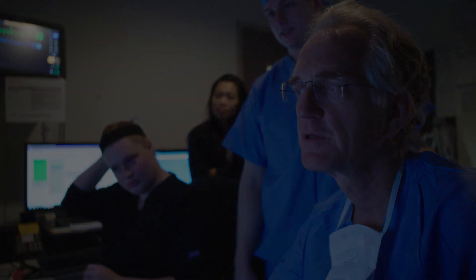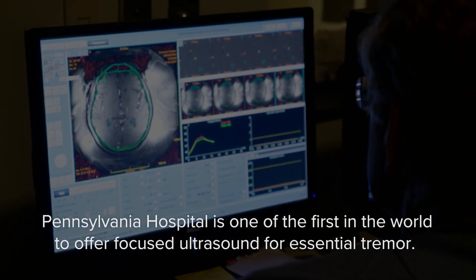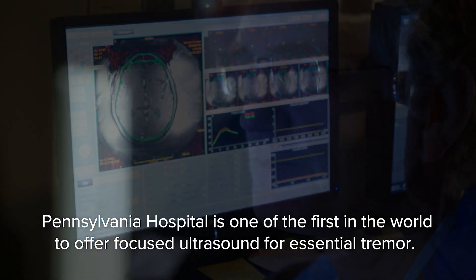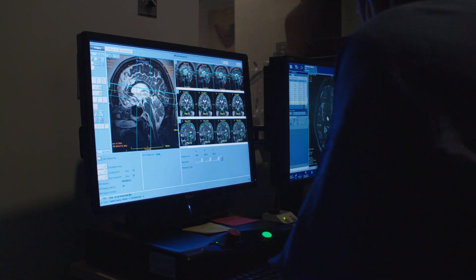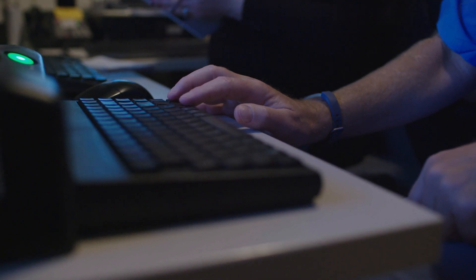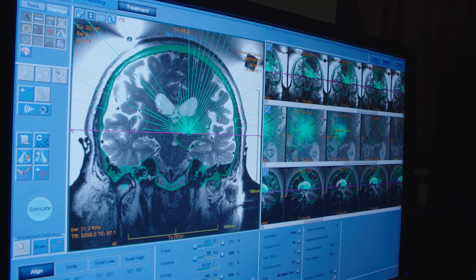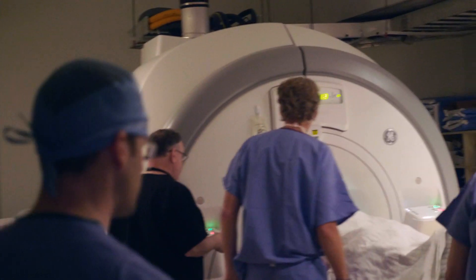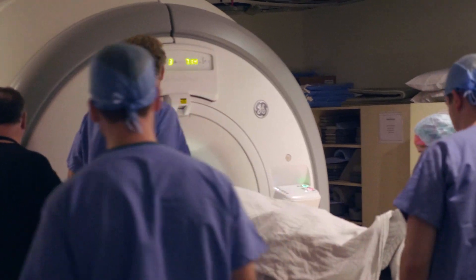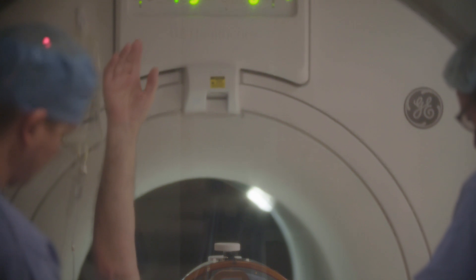Everything is ready. We're going to sonicate now. There's a shift in the right-left direction — it looks like it's a little more lateral. Let's get some real energy into that now. His blood pressure is good. He's been great. Mr. Kleinman, how do you feel? Good. I think we're good. I'm happy.